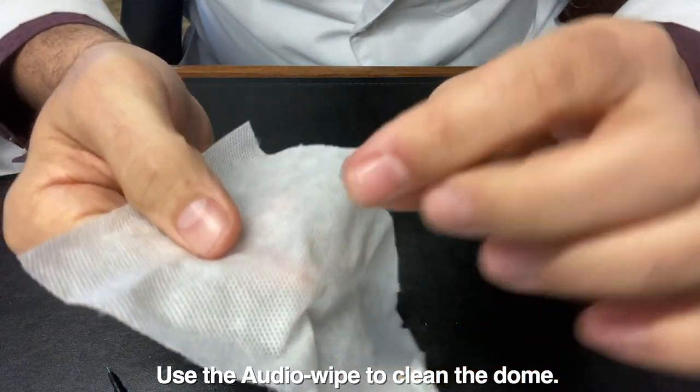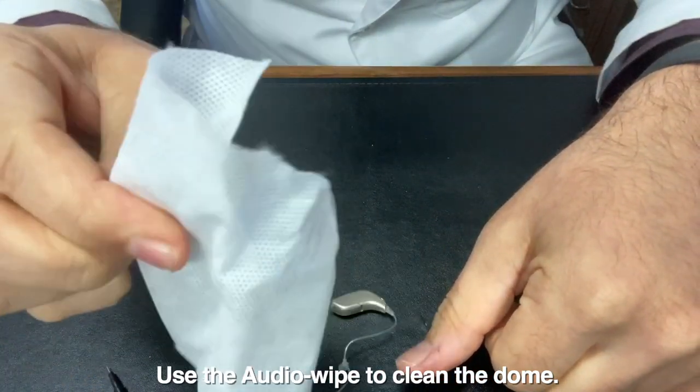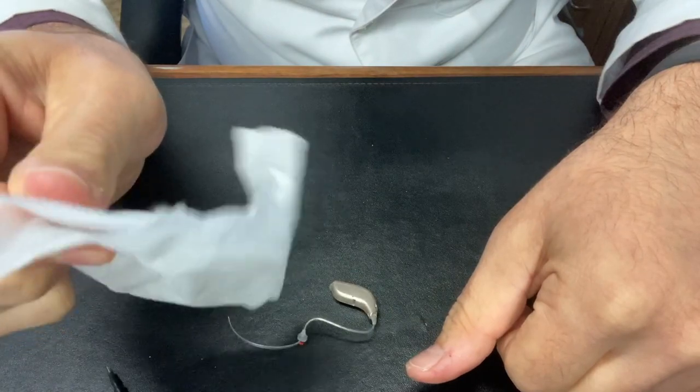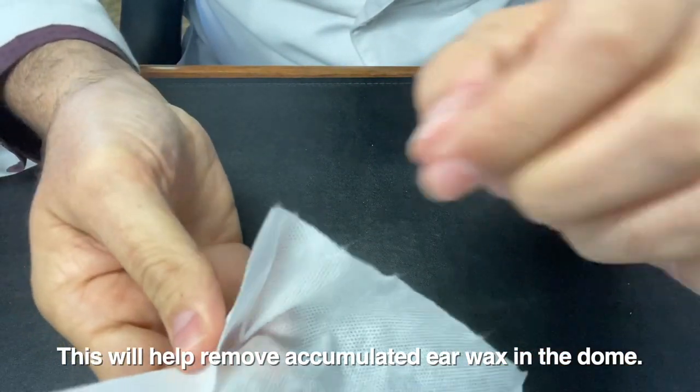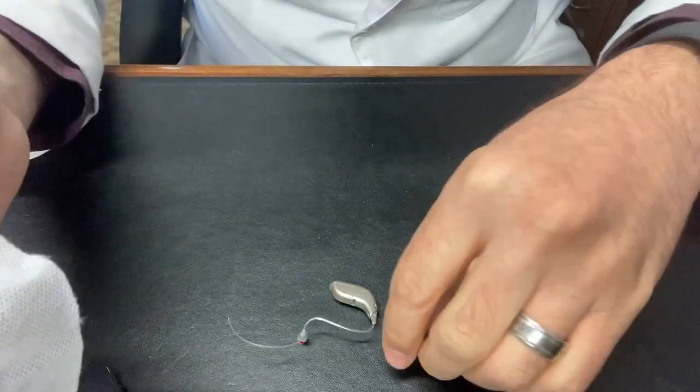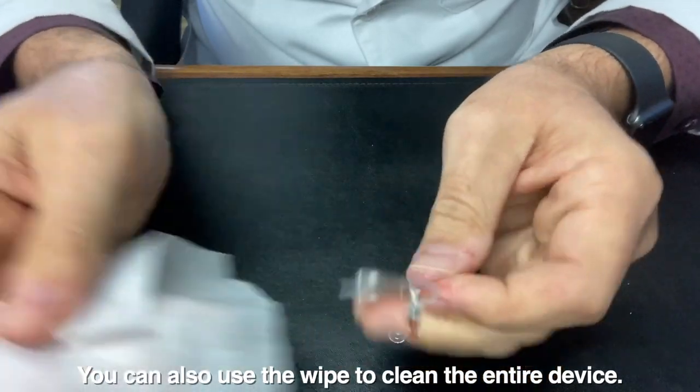I put that dome right in there and just mash it around. That'll clean out any wax that has accumulated in the dome itself. We'll put that off to the side. You can also use this wipe to just wipe down the whole thing.